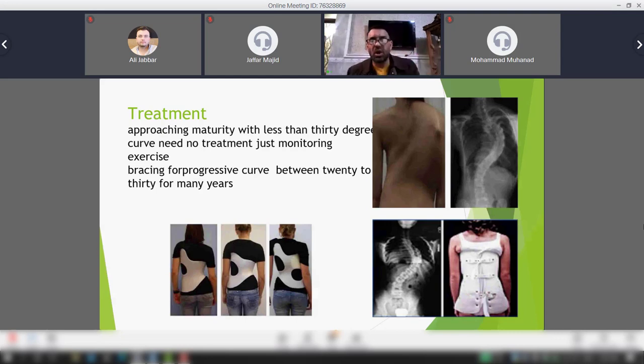Risser sign يعني شنو؟ هذا maturing apophysis of the pelvis. The apophysis of the pelvis has grades. ترجعون له إن شاء الله وتحفظوه. Grades حتى نعرفه. Risser sign بس تأخذ عنا فكرة أنه هذا ايش قد عمره؟ هل هو صحيح 10 سنوات؟ لو اقل لو اكثر؟ اول شيء حددنا chronological age و real age.